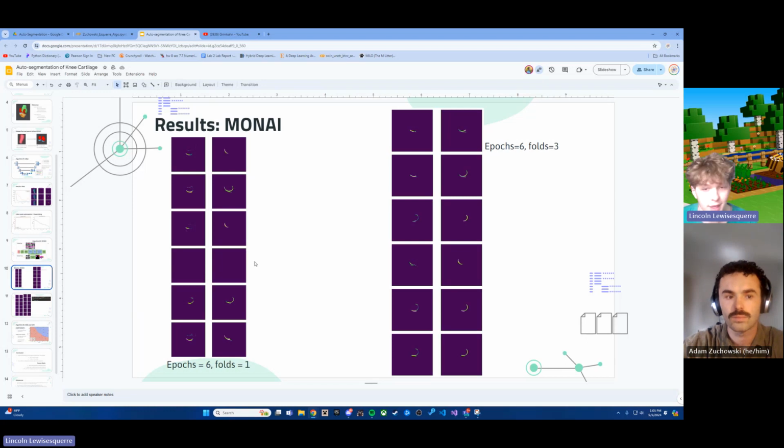So we just did 80/20 because we thought that was the best option. For this one, we made it really strict. We only did one fold, so for each algorithm we pick, it'll just train it one time for that fold. And it does pretty good here.